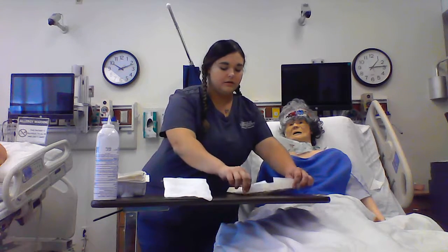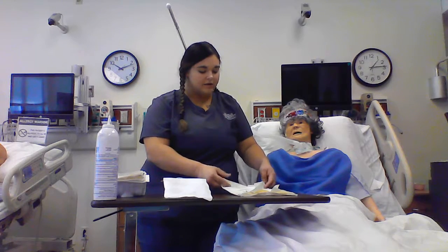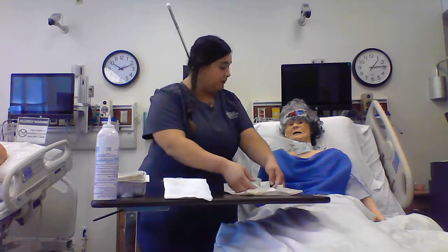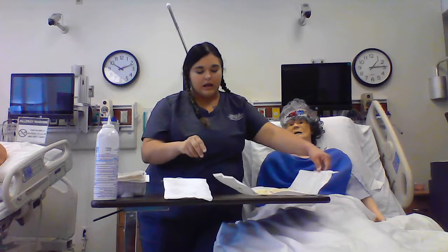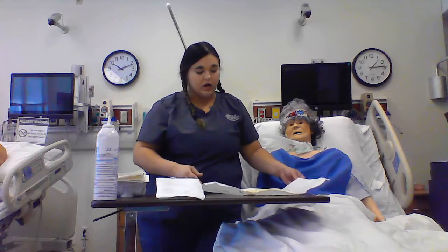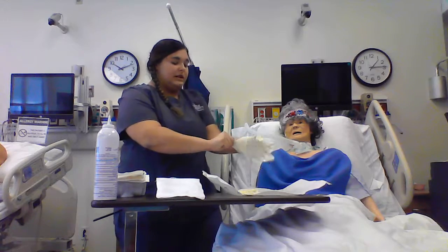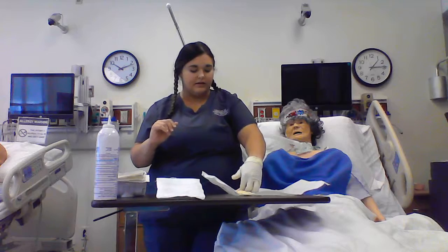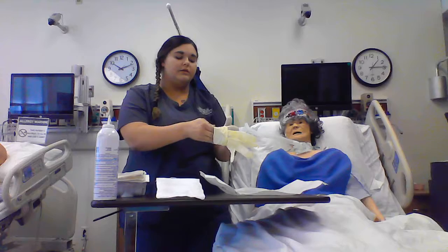I've already pre-discussed how Miss Opal can help me do this procedure. We've discussed that she will raise her left hand if she's in any kind of distress, or if I need to give her a break. She's having a hard time breathing while I'm suctioning her, or if she's in any pain, or she just plain old needs a break. So I went ahead and donned my non-dominant hand with my sterile gloves first. I'm going to don my dominant hand.